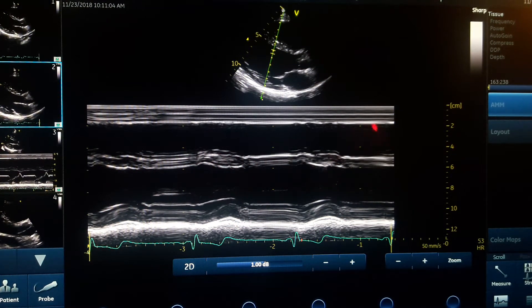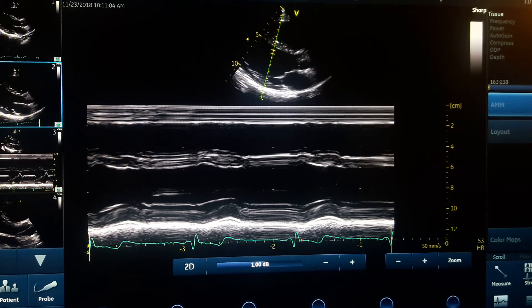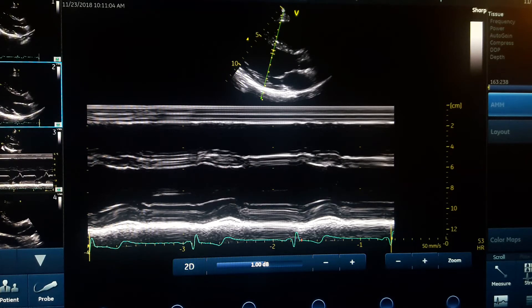Why does the pattern in each line change over time? Because the heart and all its structures move during cardiac activity. Their size, dimension, and everything changes over time, and you will see these changes reflected in the M-mode diagram.